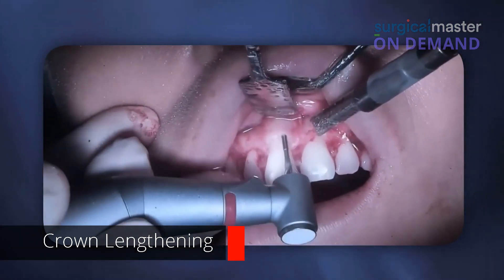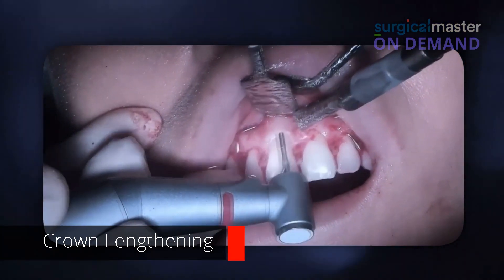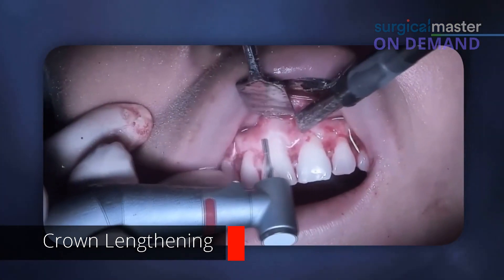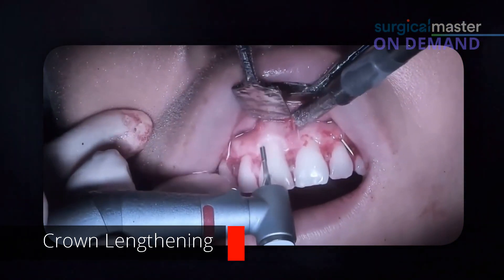Sometimes it'll leave a little mark just because of the bur — it's metal and I'm making it more round. Would you say you're following the CEJ, where the enamel meets the dentin? Kind of — I try to follow the same shape as best as I can. It's not going to damage the tooth.